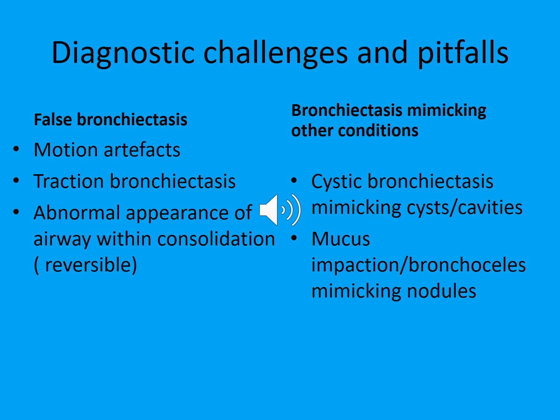Traction bronchiectasis is a specific term used to describe abnormal airways in patients with advanced pulmonary fibrosis and is not related to recurrent infections.